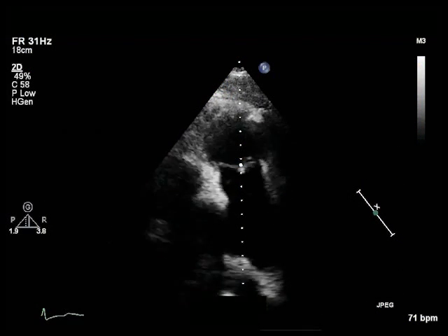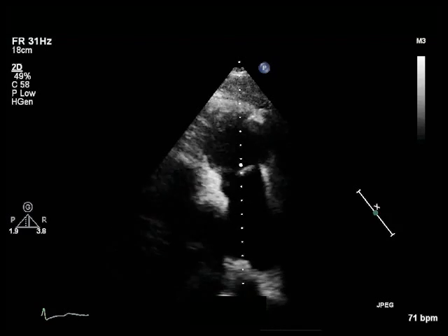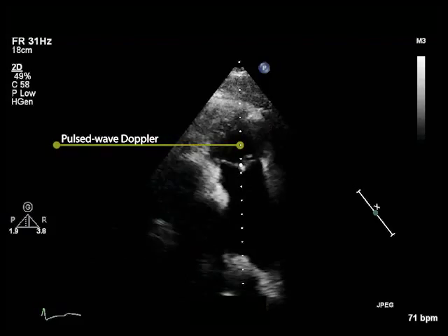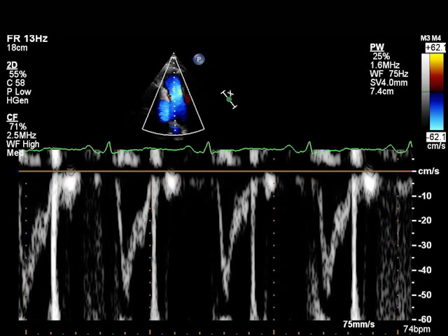The second view needed for the measurement of velocity-time integral of the right ventricular outflow tract is the parasternal short-axis view of the right ventricular outflow tract. In this view, we can obtain right ventricular outflow by using pulsed wave Doppler, with the sample volume positioned at the centre of the pulmonary artery, ideally at the annulus. Here we can see how the velocity-time integral of the right ventricular outflow tract can be measured.